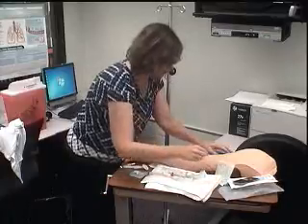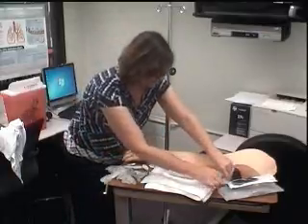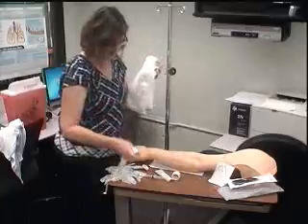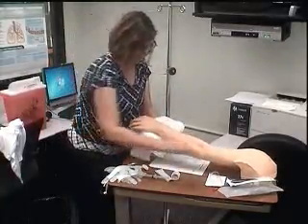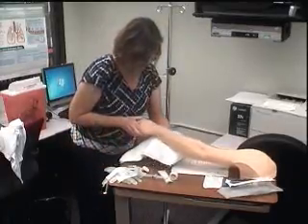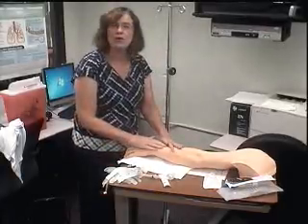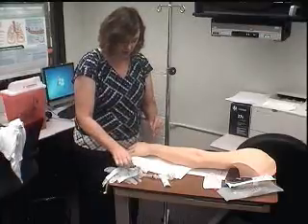Of course, this arm would not be stuck on the table. I'm going to put my towel underneath my arm, and I'm going to try and find a most distal vein. Now I have a general idea of where I'm going to look, but I don't really know for certain until I put the tourniquet on.